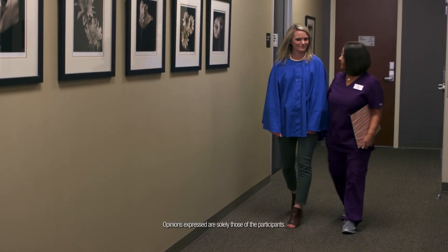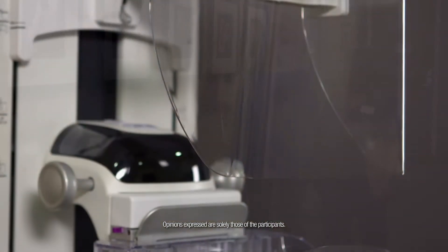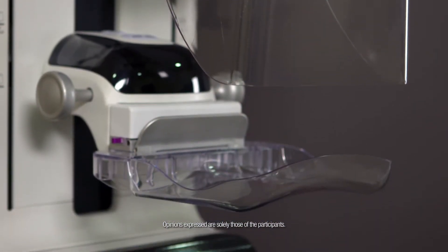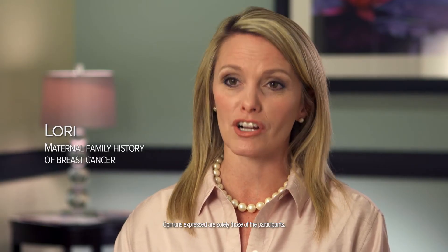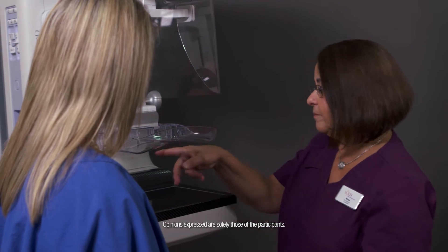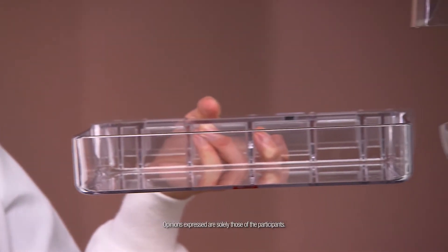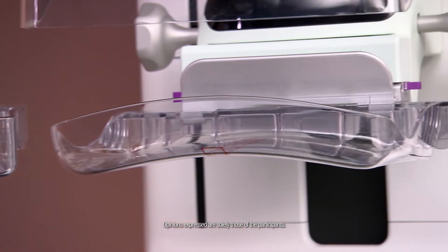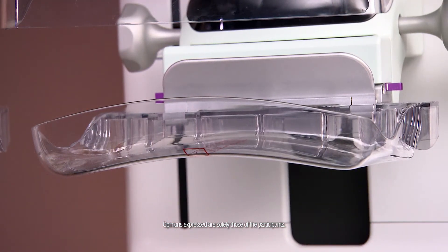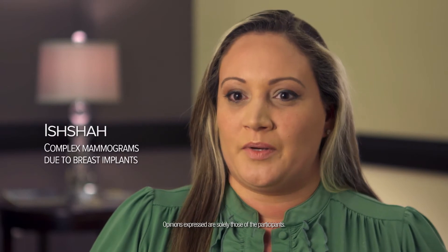Now that I've had the opportunity to try the SmartCurve system, I would definitely opt for it every time. It's much more pleasant. It didn't hurt nearly as bad, and it didn't leave marks across my chest. I noticed right away the difference — I was able to notice less pinching, and even though there was pulling, it wasn't as uncomfortable as prior experiences.